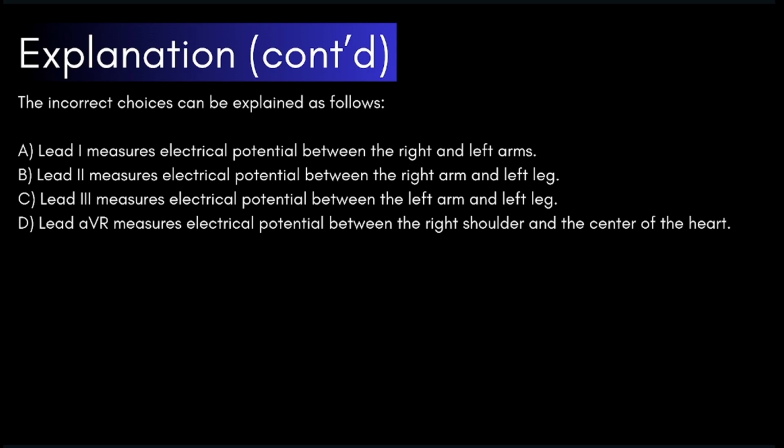But for now, since we're only on part 3, you're just going to need to memorize this information, since if you have this information down right now, going on to the next step, which is interpreting the ECG step by step with the P wave, the PR intervals, etc., you will have a much easier time if you can understand what is going on with this basic science information being presented to you.